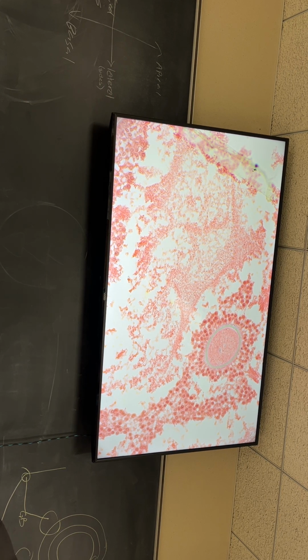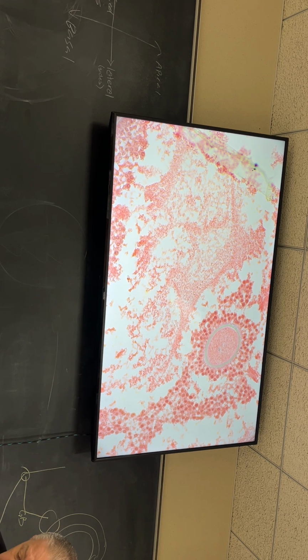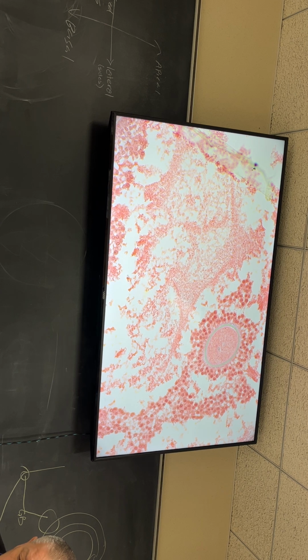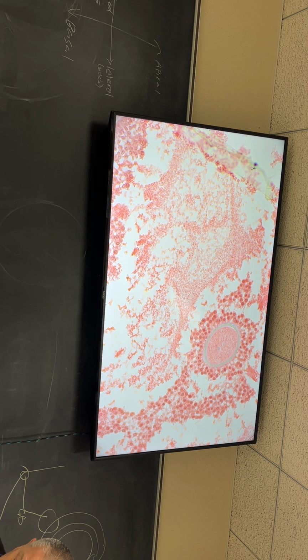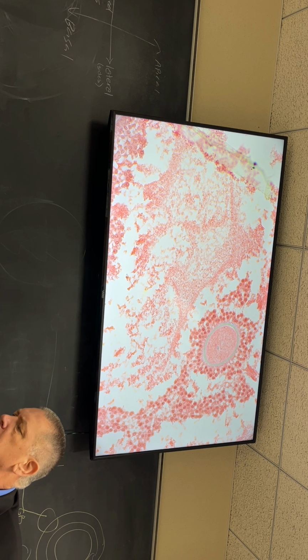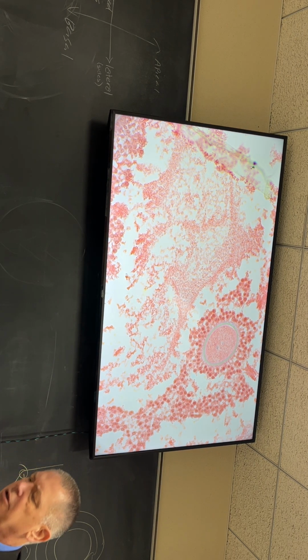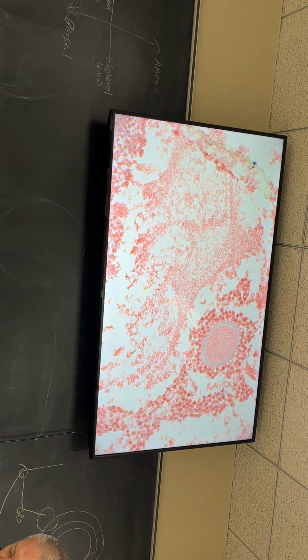All right, oviduct. Do I have an oviduct slide? I have no idea. Anybody got an oviduct slide? I've been talking with Professor Duncan about this class.